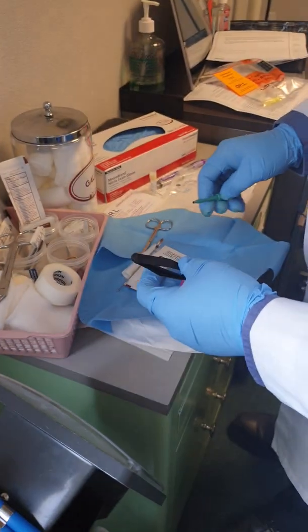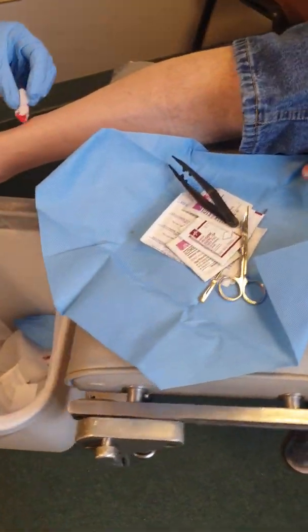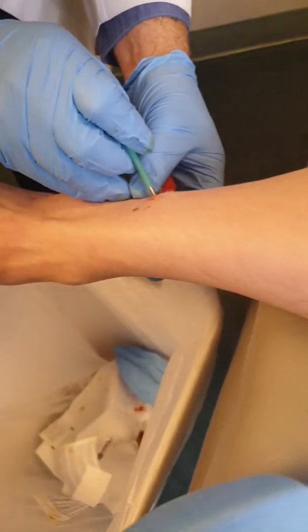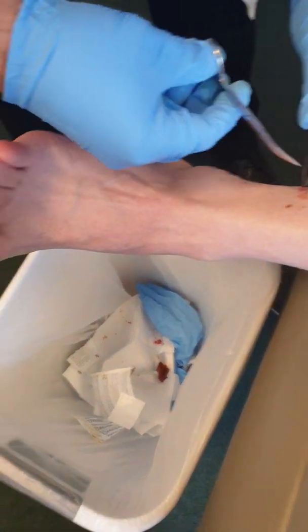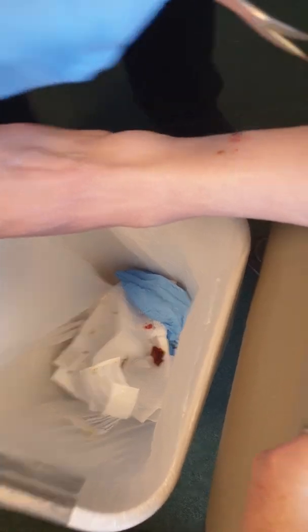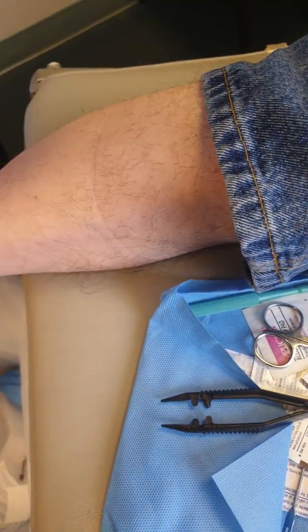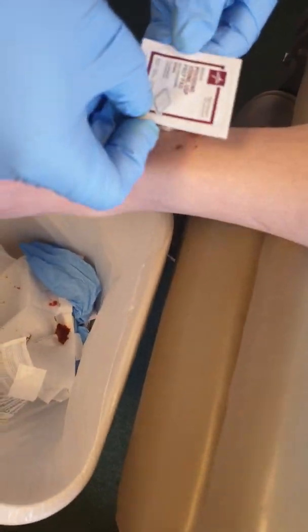Now we go to the second site. Do you feel this? No, okay, here we go. We're going to punch it out, and again I go very deep. Then you get the plug out — there's the plug. We take the plug out all the way from the root and put it right inside the vial, then cap it.